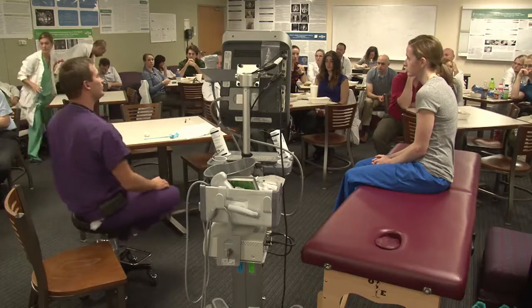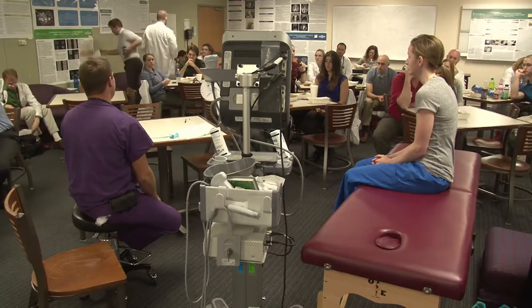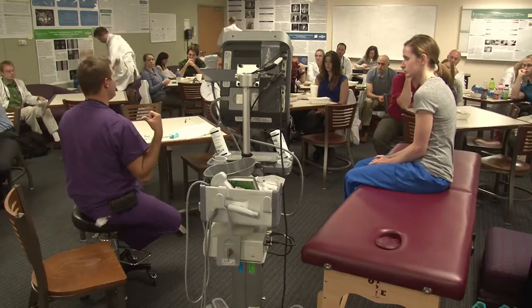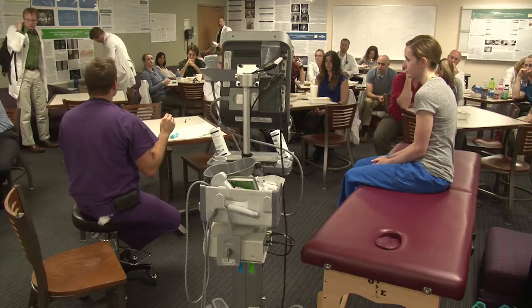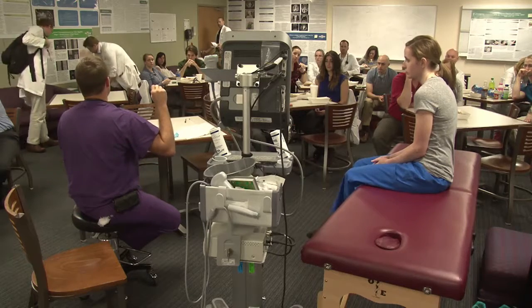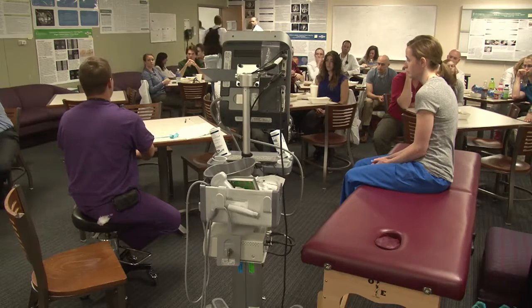Oh, yeah, something else you can do if you have a patient with bad venous access. There's been multiple sticks, and you're like, boy, I can only find one or two good ones here. Dr. Potter suggested, and he's right, you can get a little lidocaine, put it in a TB syringe, infiltrate a small wheal. Okay, if you think, boy, this is all she's got, or there's a potential to be making multiple passes at this, you can put a little wheal of lidocaine in there and pass through it.